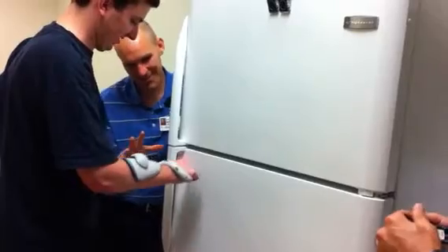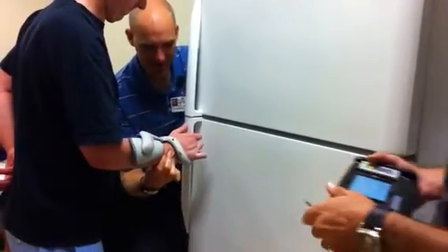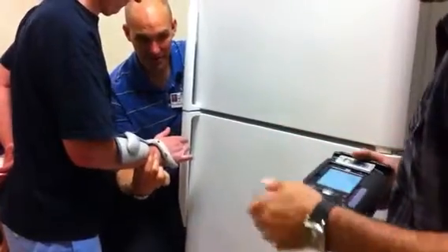So can you pop it back open? He's lost his thumb. So if we can get you... Not yet, not yet. That's just going off now.